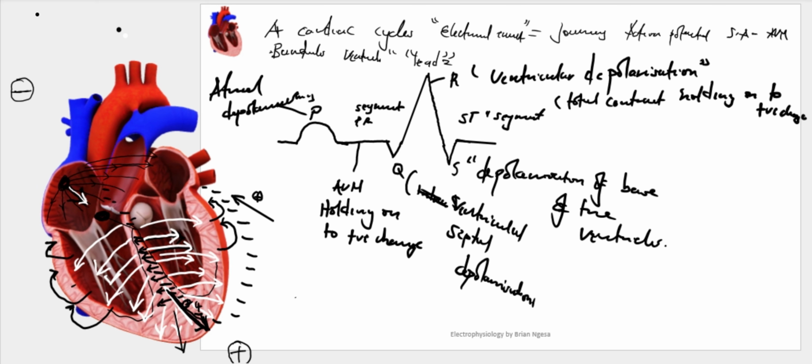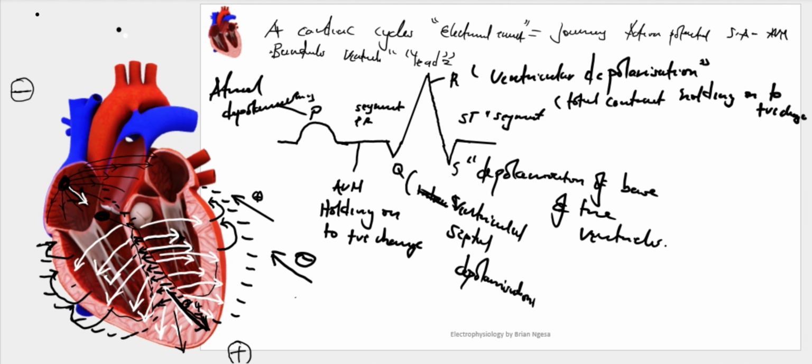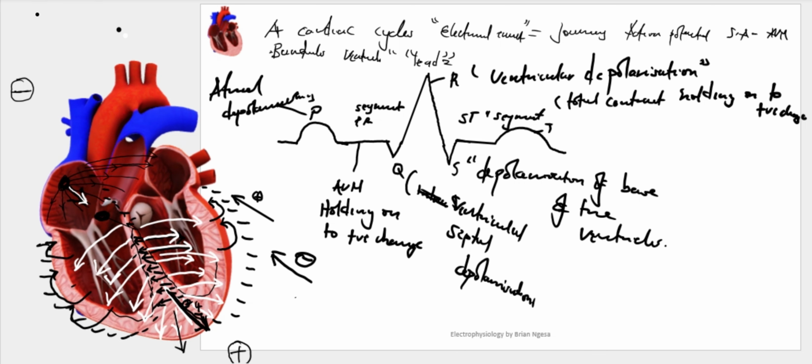So the repolarization wave, how is it likely to move? If you take the net vector, from this area, considering some also moving from this towards this direction, and then again they converge towards this direction. So it is likely to seem as though we are having the net movement of negative charges toward this direction. And because we are having negative moving towards the negative, what kind of curve do we anticipate? An upward deflection. An upward deflection representing the T wave.